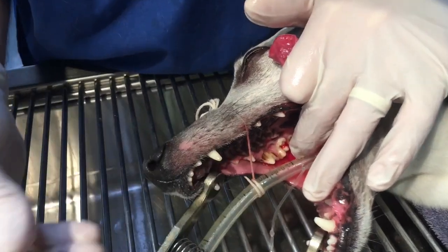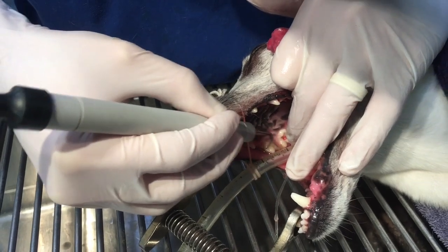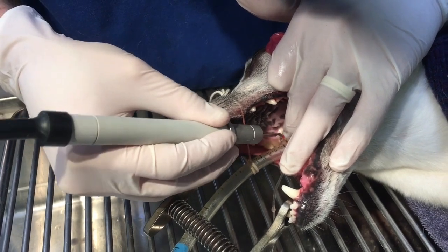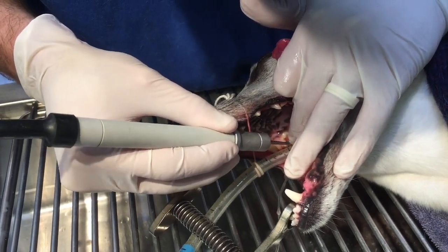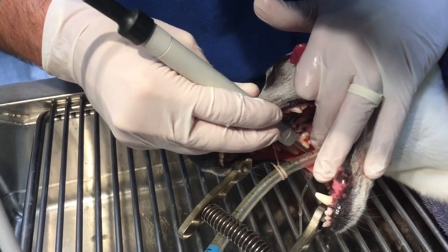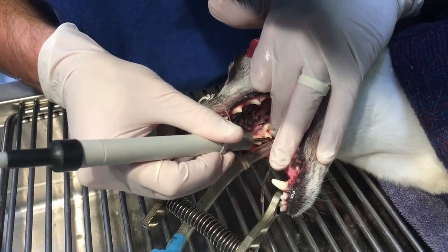You can see up here the inside of this fourth upper premolar — we've got a little bit of tartar up here on the inside section. We always try and make sure we move from tooth to tooth, so you might see me go back to other teeth again after having finished with them. You don't want to have the scaler on the tooth for too long — too much vibration is not good for blood vessels and nerves. You can see that there's water coming out of the scaler — that's there to help keep everything cool, because if it gets too hot it can cook tissue.